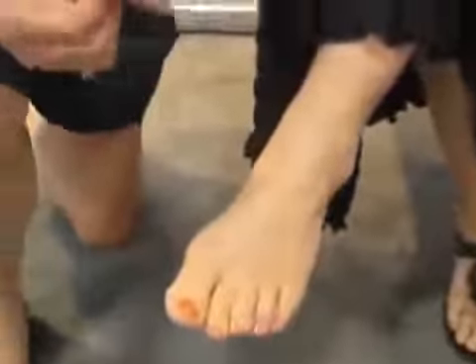Now, we have a lady here who has a mild bunion, and this is a great product that will help her relieve her bunion pain, but also help correct the malpositioning of the toe.